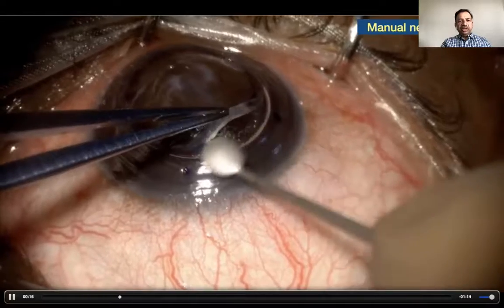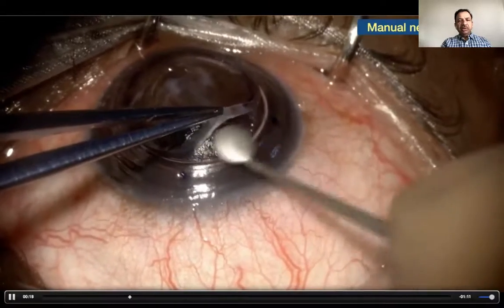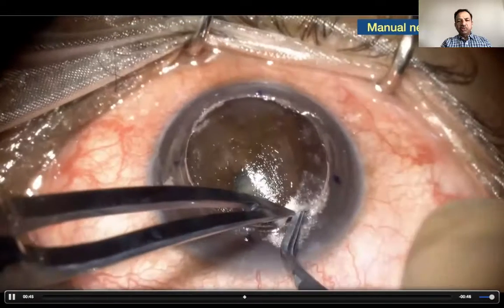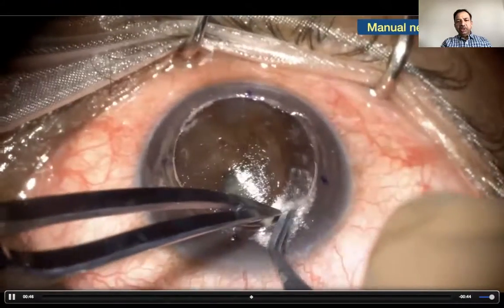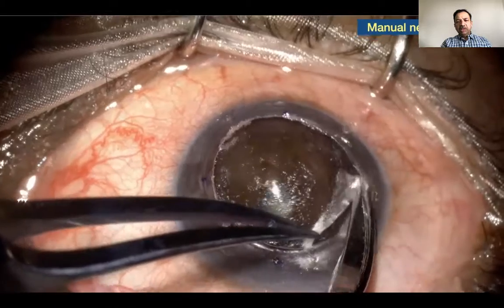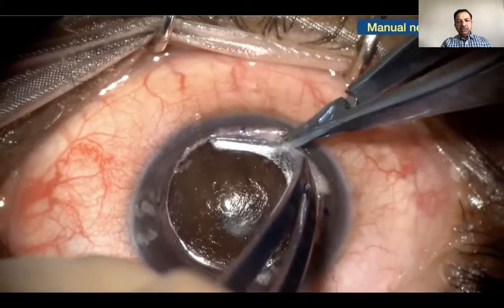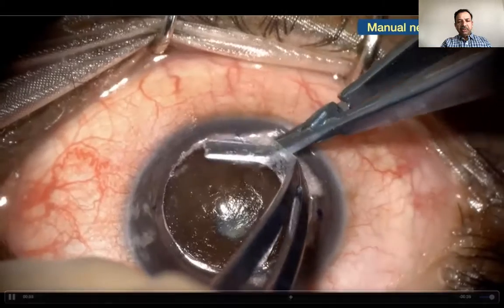So you do your trephination, perform the initial debulking where about 40 to 50% of the stroma is removed. And thereafter we make a deep peripheral pocket, and then we use the stromal pocket forceps to create this peripheral pocket along the trephination mark.